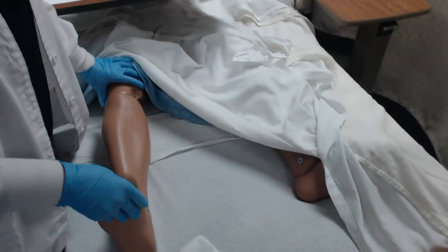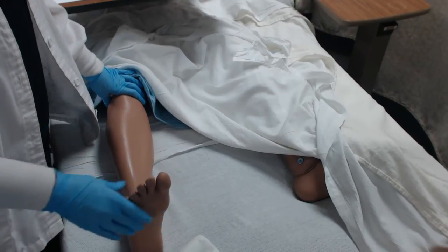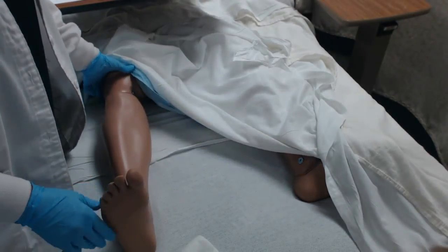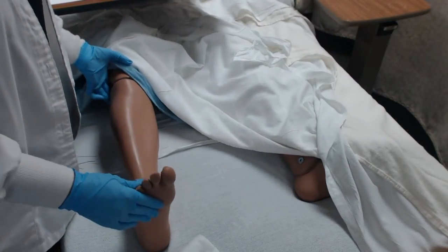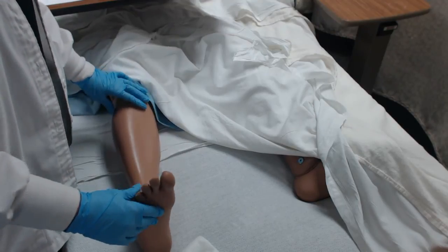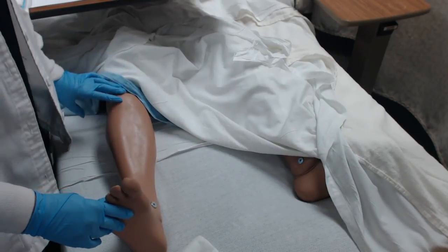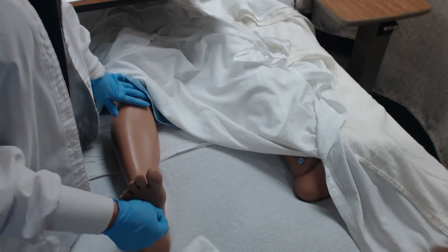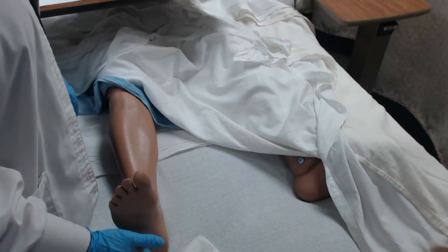So certainly before you put on the stockings, you need to look at the extremity, make sure the color looks appropriate, it's pink, you're getting good CMS. So remember, C stands for circulation. We can tell circulation by the color of the extremity. This patient's extremity looks great. M is motion, so we would ask the patient to move, and they move fine. And S is sensation, so I might either take a cold alcohol prep and ask, can you feel this? Or I would take my finger and say, can you feel me touching you here?